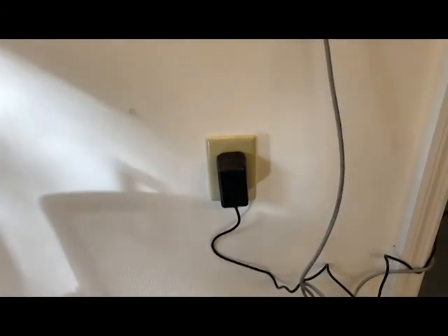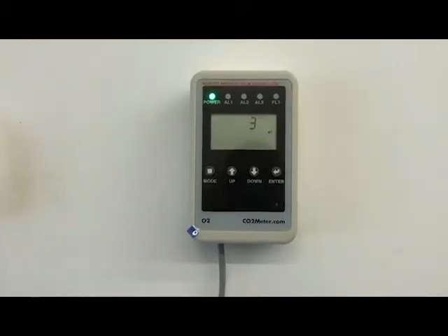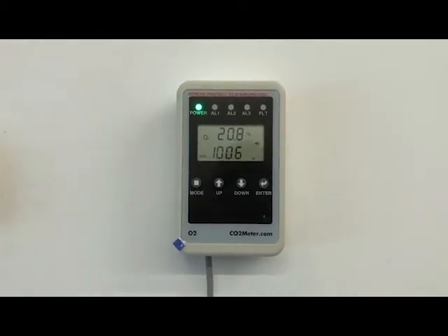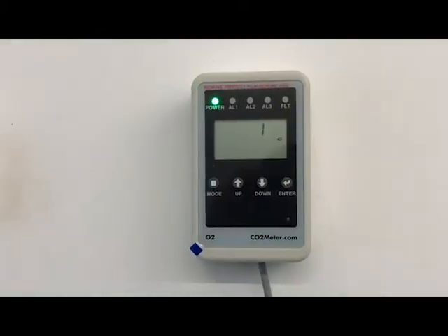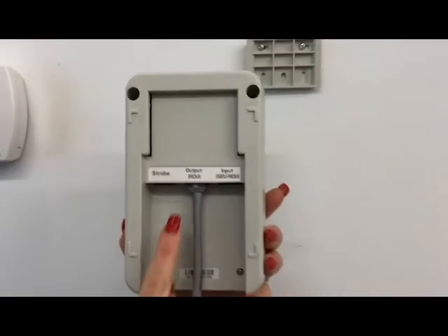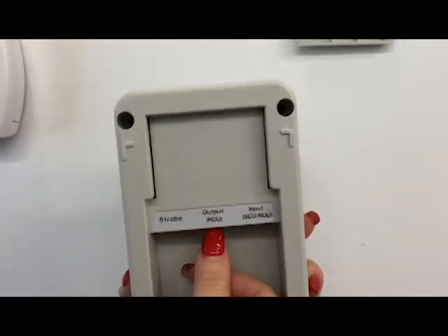Next, plug the main sensor unit into the wall outlet to provide power to the device. Once the power has been connected, your remote oxygen depletion safety alarm will perform a self-check and countdown. If the main sensor does not complete its self-check and countdown, ensure that the CAT5 cable is plugged into the correct port.